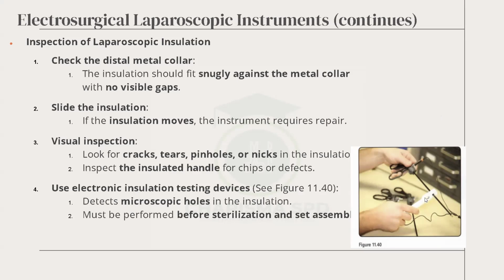So he's passing the tester through the shaft. If there's a break, you hear a sound. If it travels the whole length and you don't hear any sound, it means there's no break. Okay, that's how we test it. If there's no sound, there's no break.